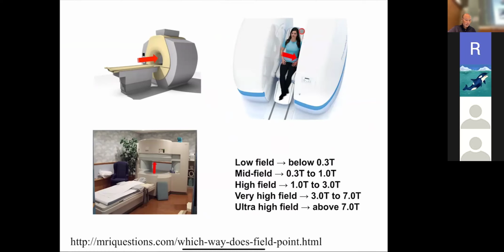Yeah. Typically these wouldn't be used for brains. They're typically used for extremities or looking at the spine or something like that. So if you really wanted to have a brain exam done, you would probably just go to a regular magnet. Or I can show you, there'll be some other examples we can show you. But even though you're thinking about your CT projects now, thinking about the MRI projects, looking at open MRI designs certainly would be something that we're not going to cover too much in this class. So that's certainly an interesting area to look into.